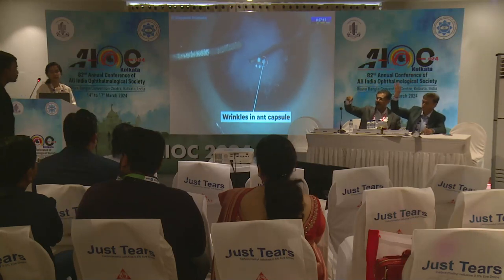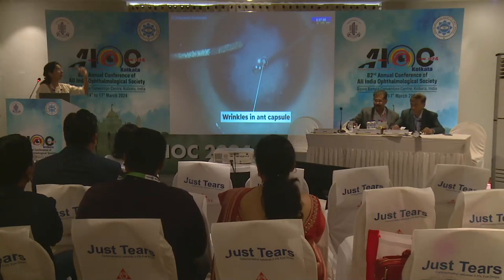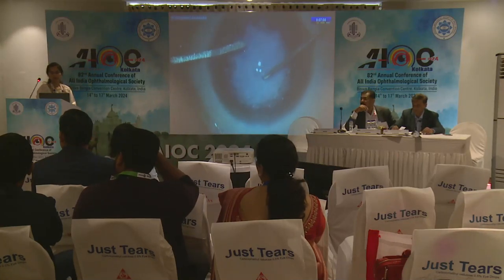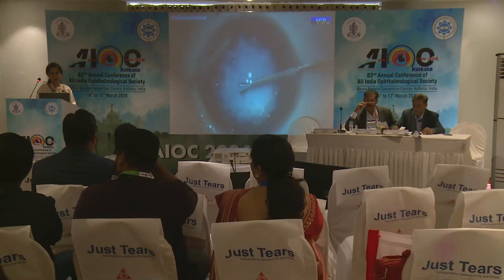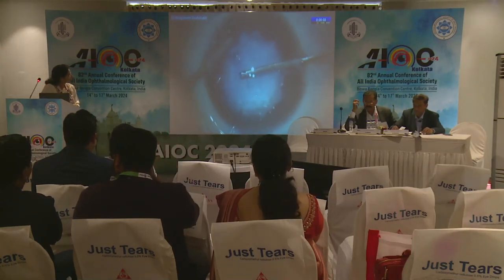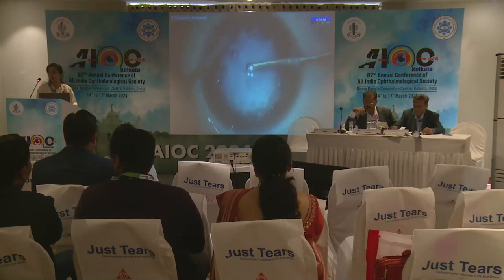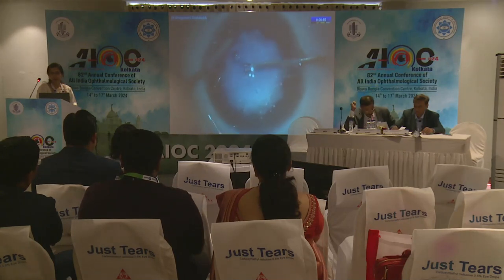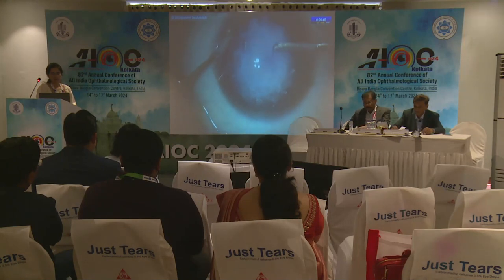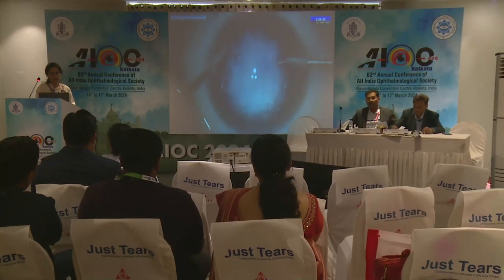Initially, I tried to make the capsulorhexis with a cystitome, but as you can see, the anterior capsule is stuck to the membrane. So I switched to microcapsular forceps, trying to find the plane between the anterior capsule and the fibrous membrane. As you can see, it is so firmly stuck that if you pull the anterior capsule, it is causing stress on the zonules. And finally, I find the right plane and complete the small capsulorhexis.